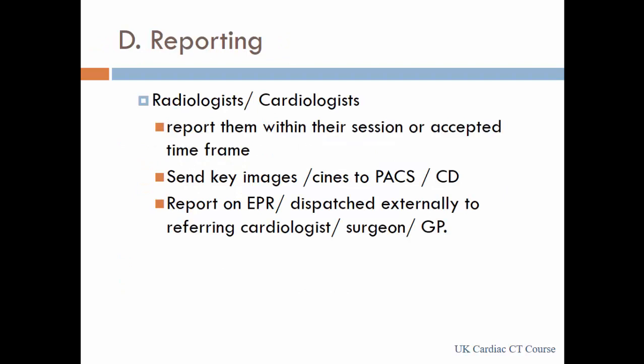So in terms of reporting, I try to report all the scans in the same session that I'm doing the CT angiograms. So I'm reporting them as soon as they are acquired, immediately after that. Some people, I think, do it differently. They just focus on getting the scans done in terms of the procedures, and then they will sit in another session, another time, and report them. Both ways are fine. It depends upon how it works in your department.